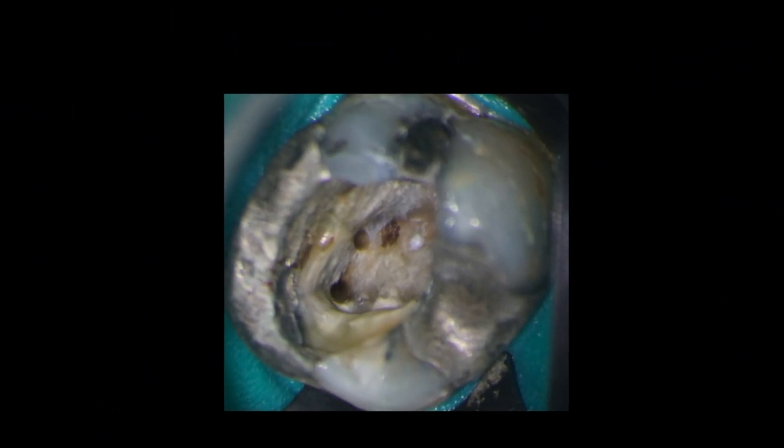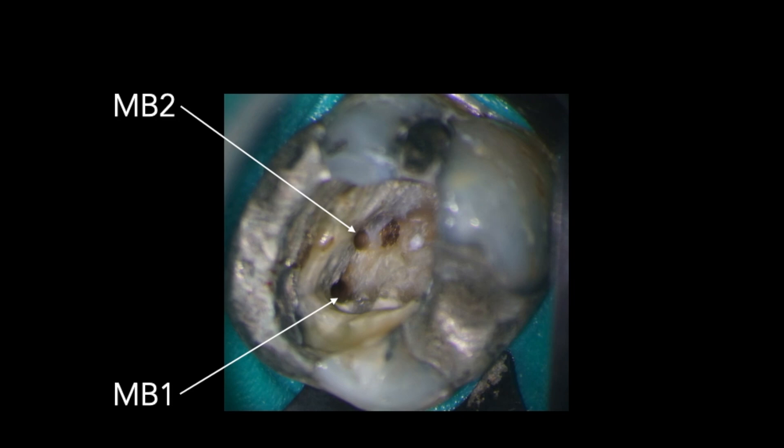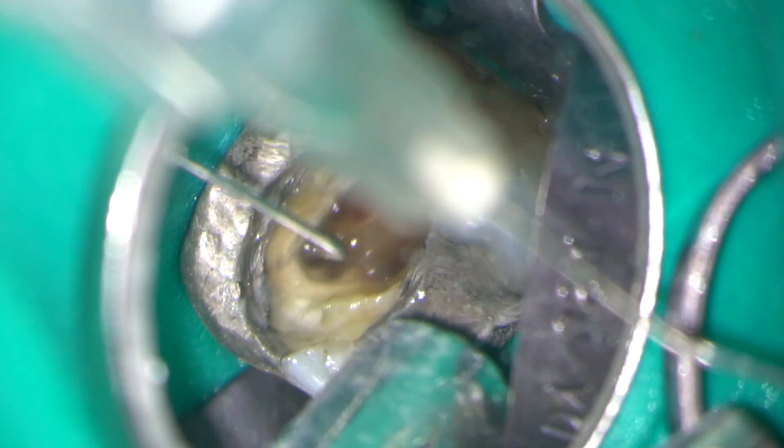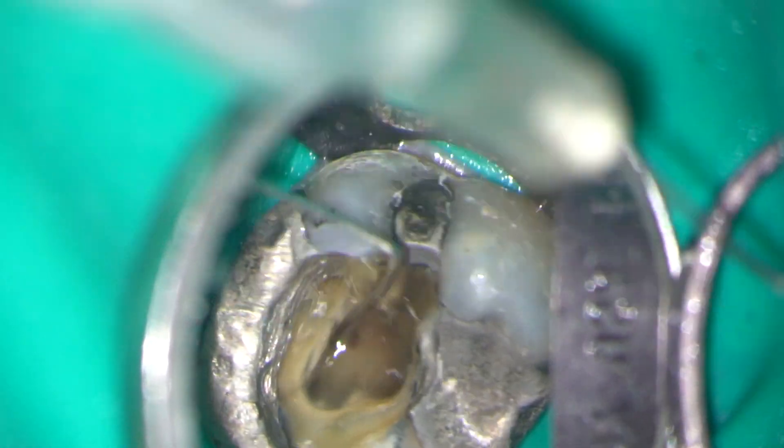Preparation is now complete and we can look at the pulp floor under high magnification. You can see the MB1, the MB2 and the perforation site. Irrigation was carried out with 3% sodium hypochlorite agitated with the endo activator. You have to be very careful not to inject hypochlorite through the perforation.